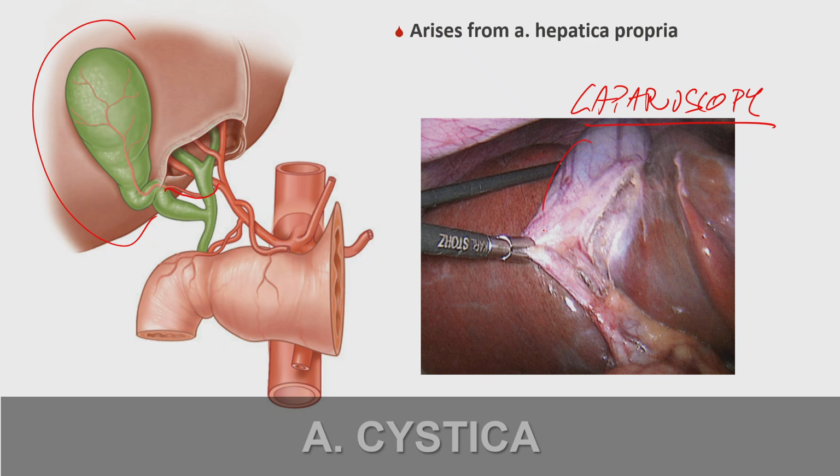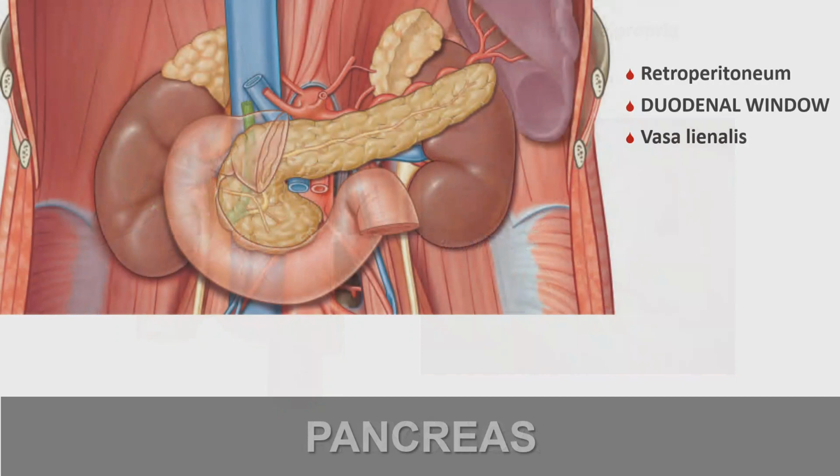Laparoscopy is seen here. This is a gallbladder, and here cystic duct and cystic artery. You can see it here. Those structures should be ligated by a surgeon before removal of the gallbladder. So those are liver and then bile ducts.